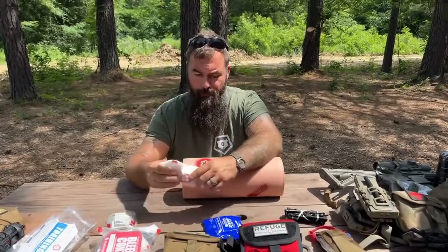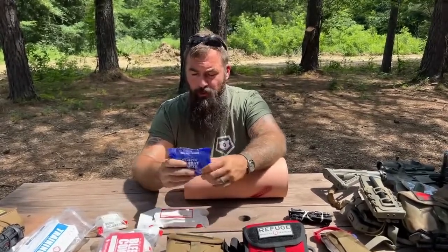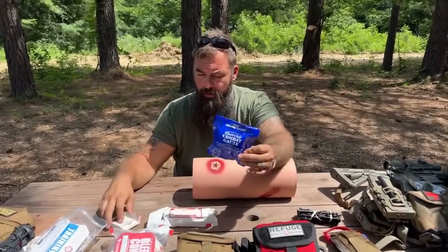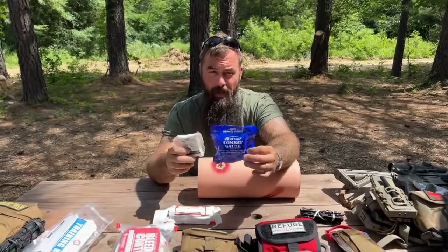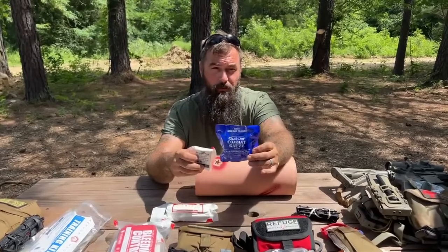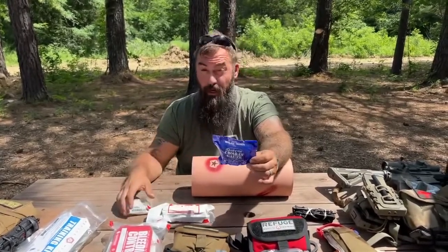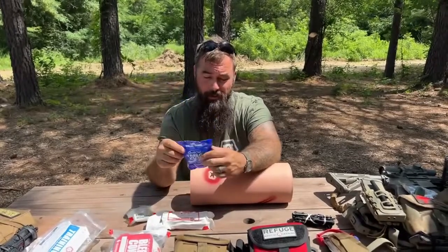This is a pressure bandage, and this is our inert combat gauze trainer that simulates a hemostatic agent. The 75th Ranger Regiment did a study on hemostatics versus compressed gauze — $43 versus $3 — and found no appreciable difference in performance between the two products. That being said, I like hemostatics for injuries in the pelvic girdle region because the femoral arteries run through there and it's a very difficult place to render aid. If you have a puncture wound or gunshot wound to the pelvic girdle, not only is the ball joint mechanical function compromised, but you have a bleeding vessel the diameter of your thumb dumping out inside that wound cavity.